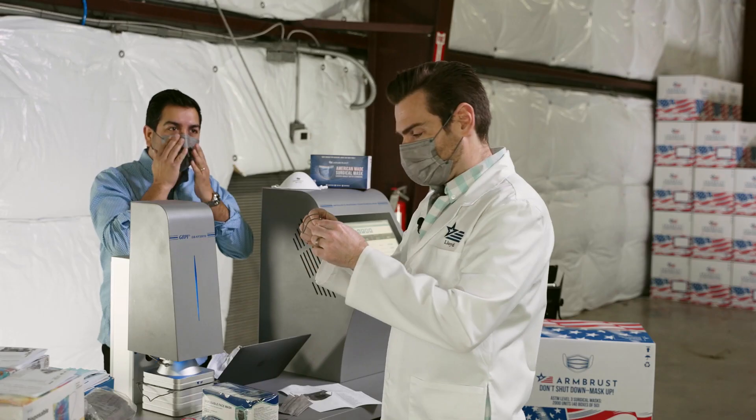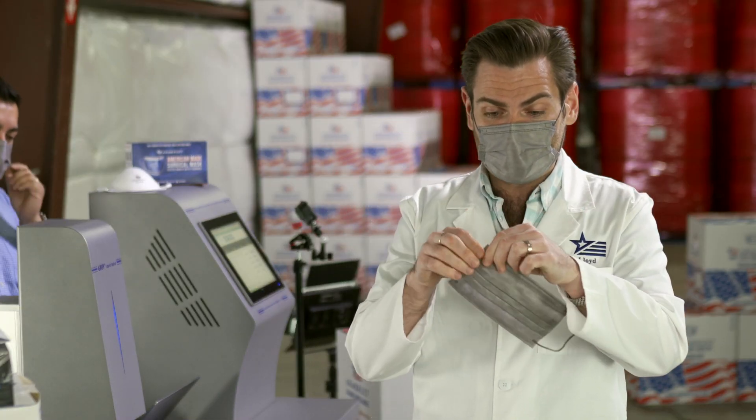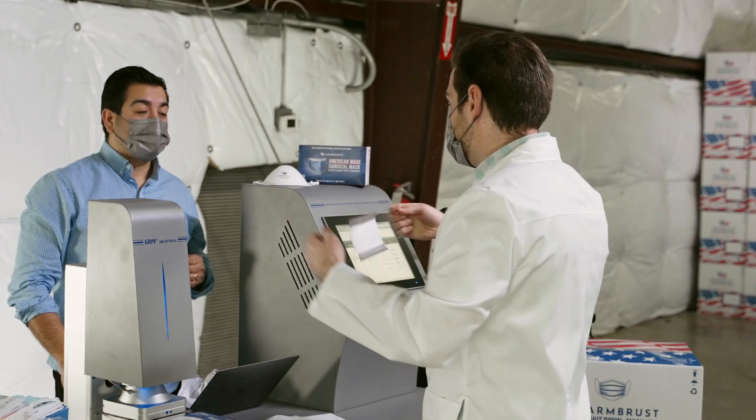I'm putting this on — it's a pretty good fit. Let me test the welds here. The welds are really good. This is done with sonic welding technology. Look at that — let's try to break this. That is really strong.